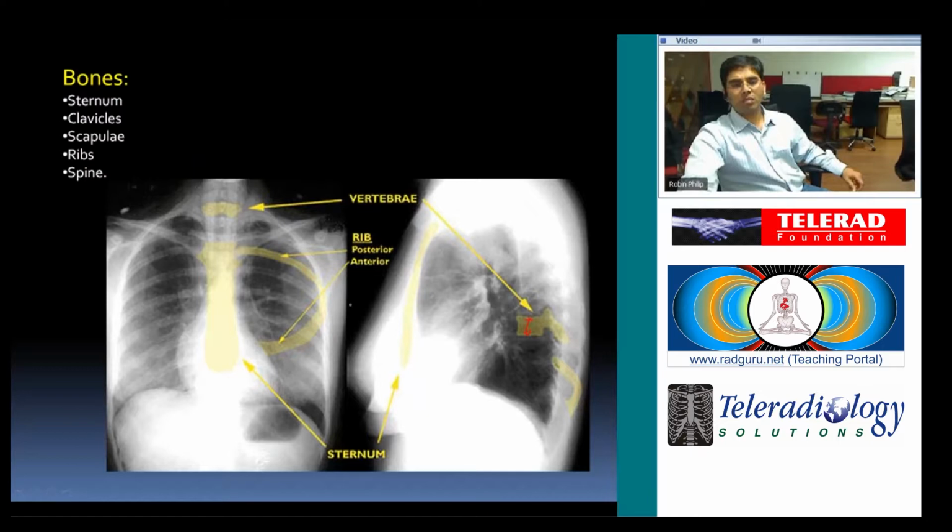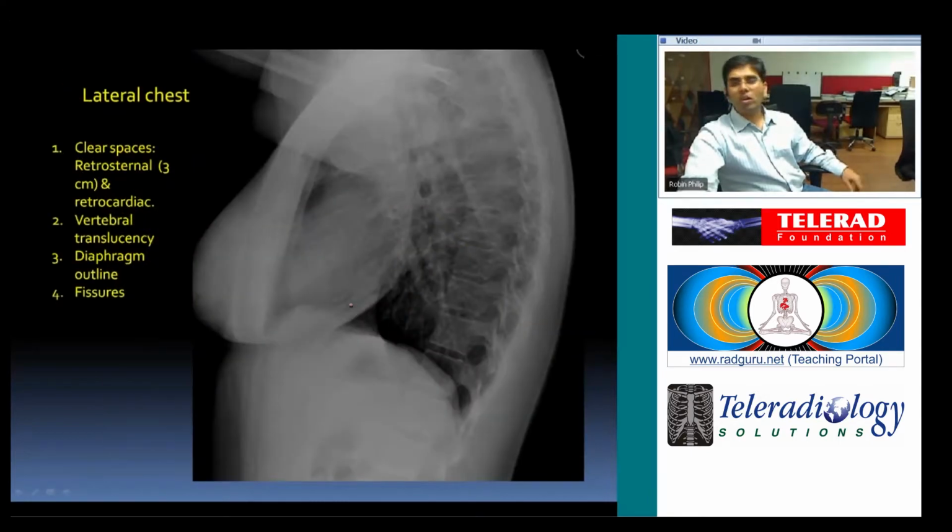Right. And then moving on to the lateral radiograph, how to interpret this lateral radiograph. So you can observe this. This is the cardiac shadow here. And you can look for the diaphragm, dual diaphragms. What is seen under these cardiac margins is the right dome, because the left dome, you can see from here on, the anterior part of the left dome is not visualized because the heart is sitting on that. Hence, the diaphragmatic margin is obscured.